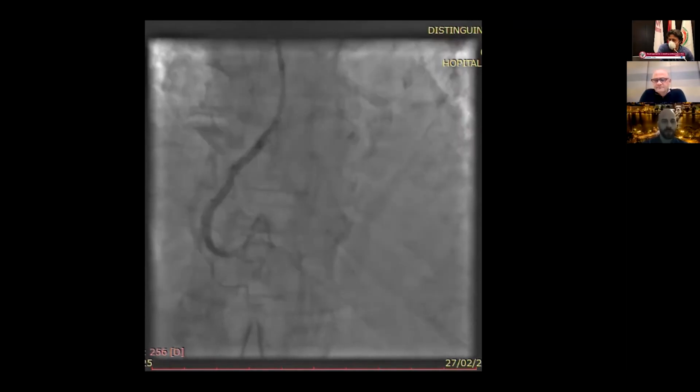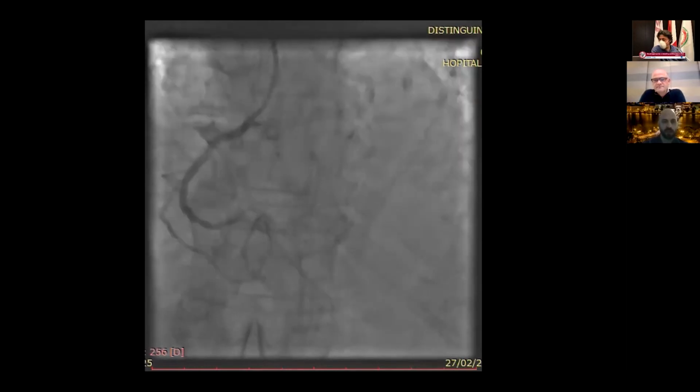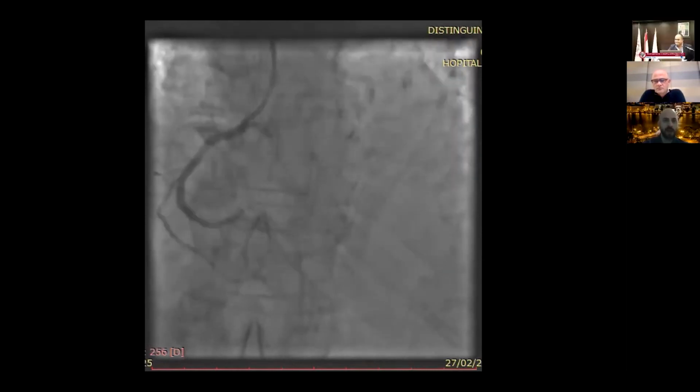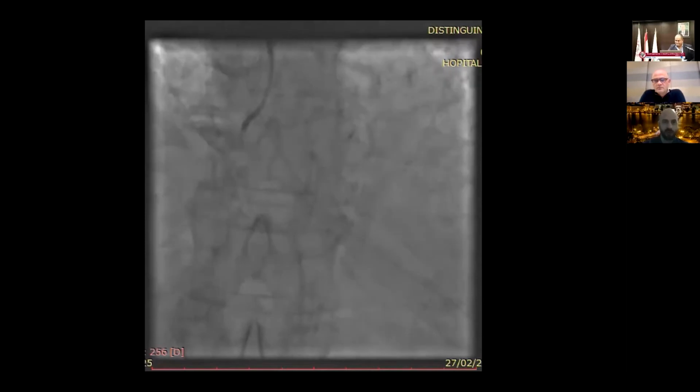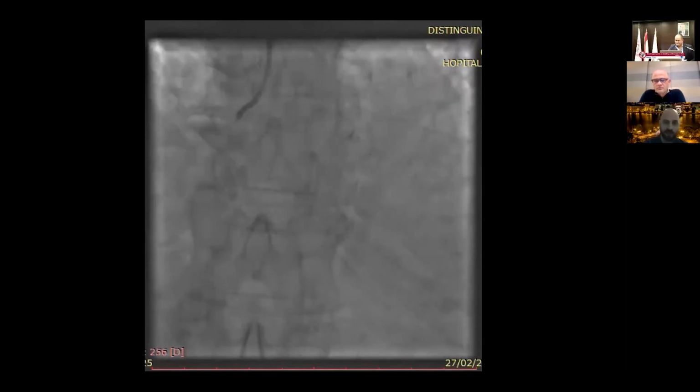Respectfully, I have experience with the shockwave balloon. We are using the shockwave balloon at our center. To be honest, it's not my favorite device. First of all, it's extremely bulky. It's difficult for it to reach the lesion. So much so that I'd say in about 50% of the cases, prior rotational atherectomy is needed for the balloon to pass where I want it to get.